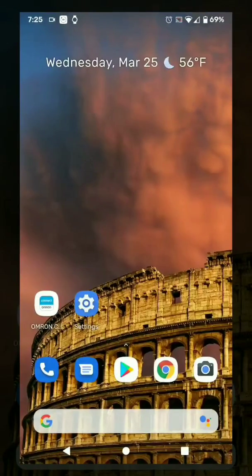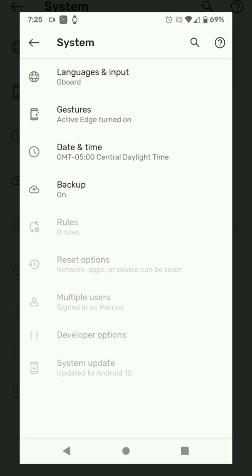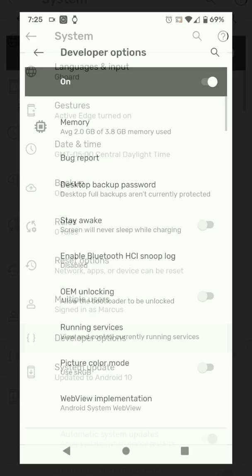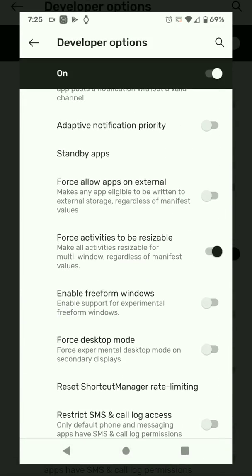Next, I'm going to show a failure. To set it up behind the scenes, I'm going to go into the developer options and make sure that 'force activities to be resizable' is on, which lets me do a multi-screen and have both the Omron app and the Bluetooth settings up at the same time so I can see what's going on behind the scenes.